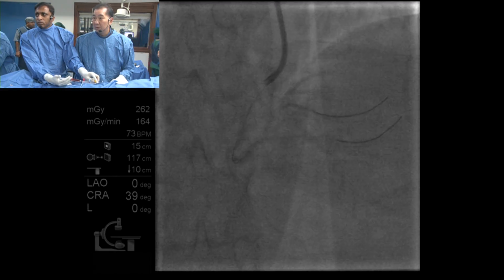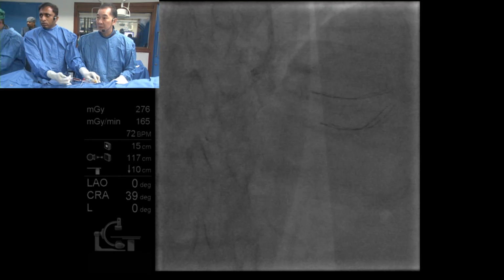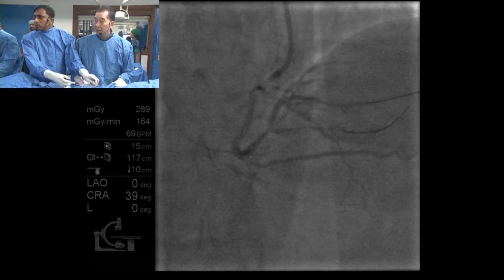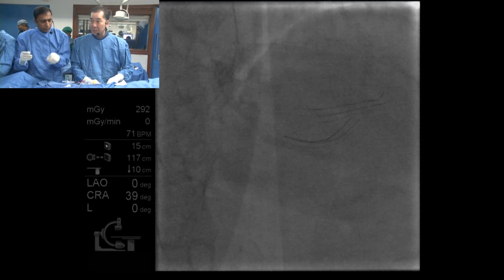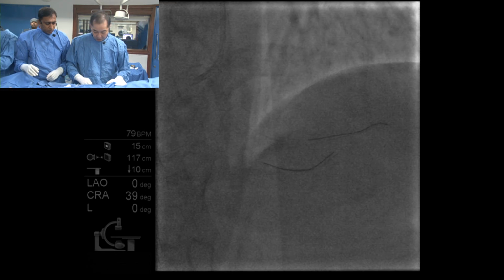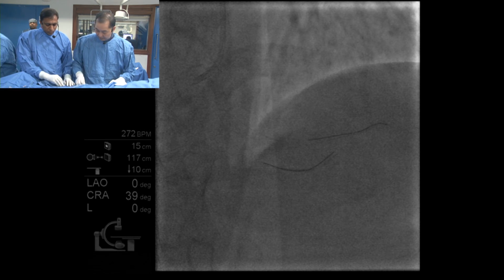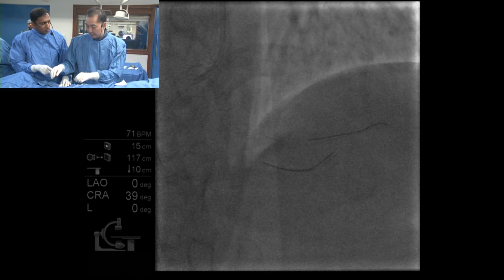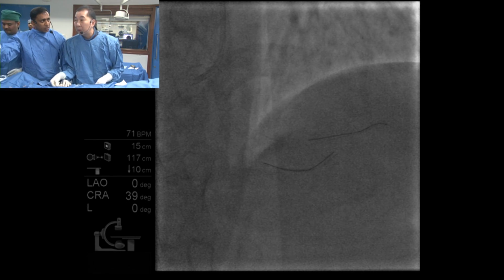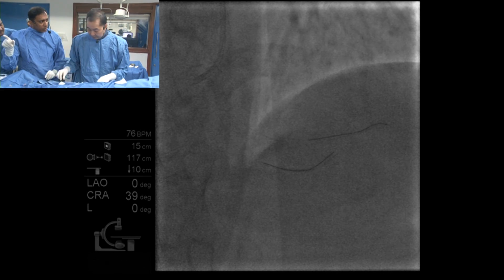So you want to routinely dilate the side branch with more than 50% stenosis. But someone will argue you might create some dissection in the side branch using this strategy, which then forces you to a 2-stent strategy. What do you think? I agree. Anytime you balloon anything, you can create a dissection. Correct. But that's why I like to use cutting balloons, because you have not just longitudinal fibers, you have cross-sectional fibers that you need to get dilated, and I think cutting balloons allow a slightly lower risk of an uncontrolled dissection.